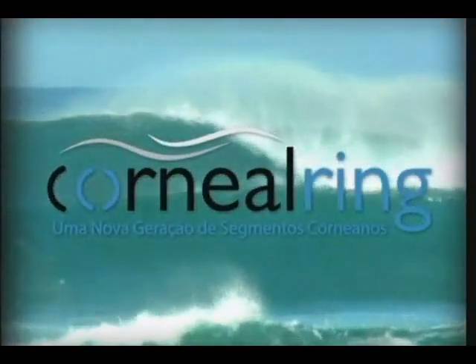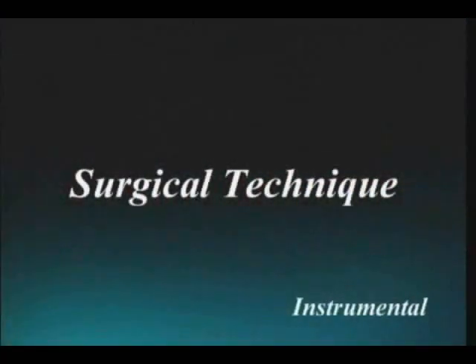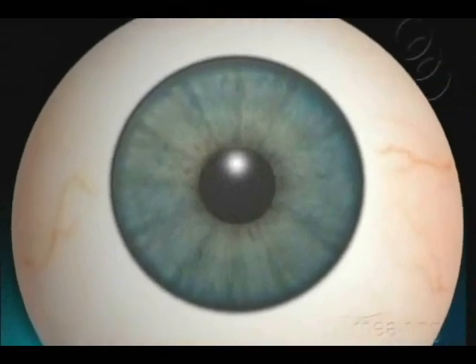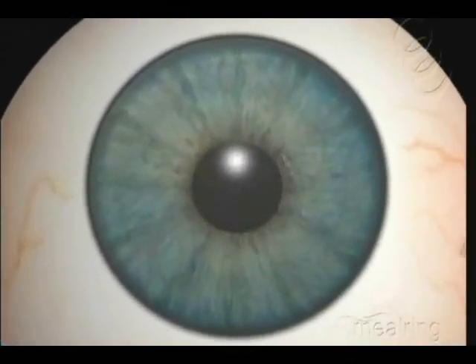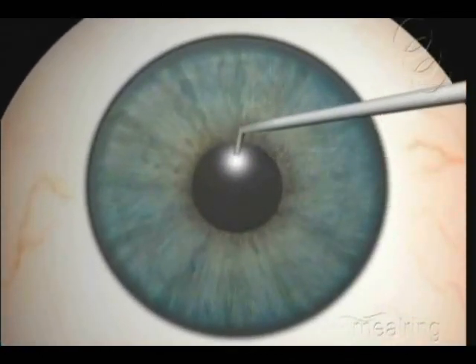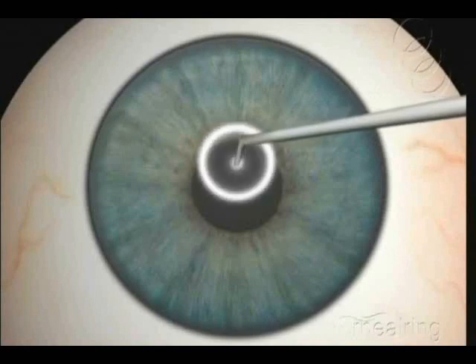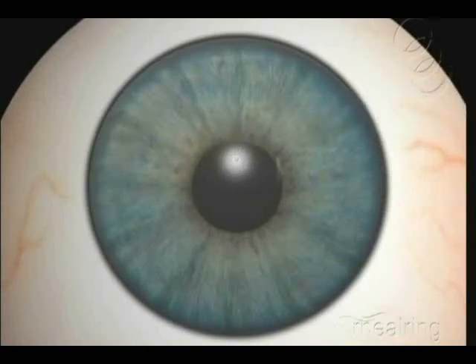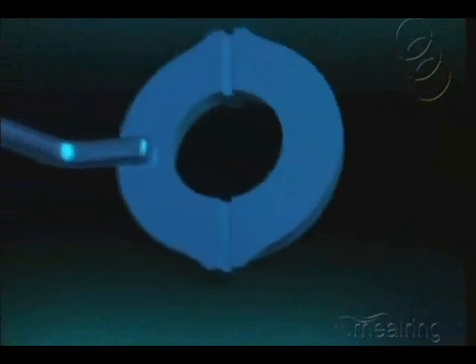Corneal ring, the new generation surgical technique. Ask the patient to look at the microscope light using the Sinski hook. Mark the light reflex in the cornea, considering the visual axis, not the pupil center. The double marker has to be positioned correctly.